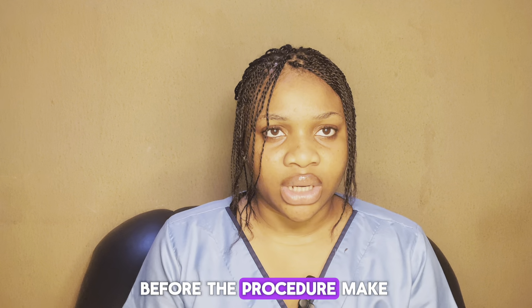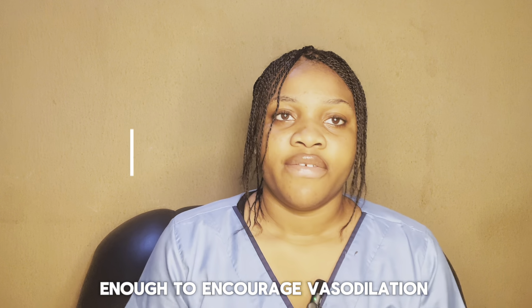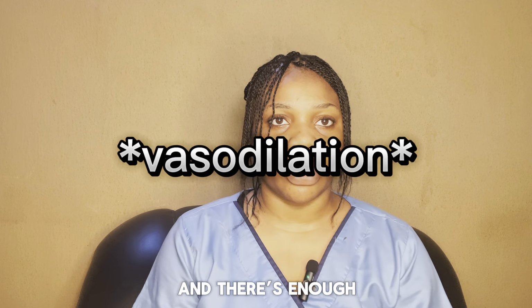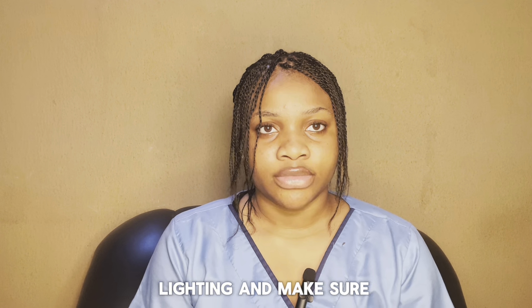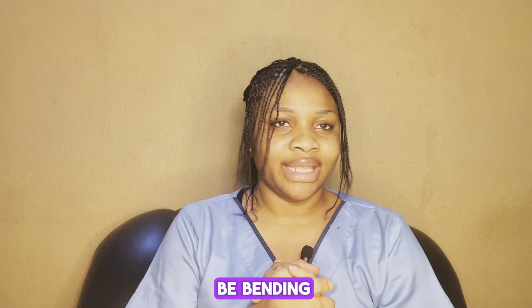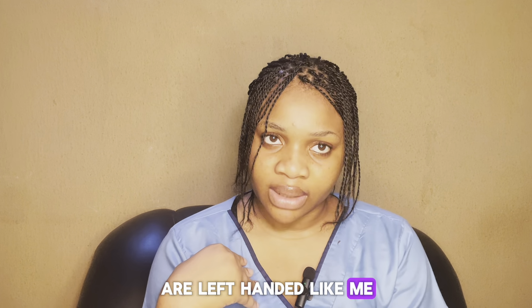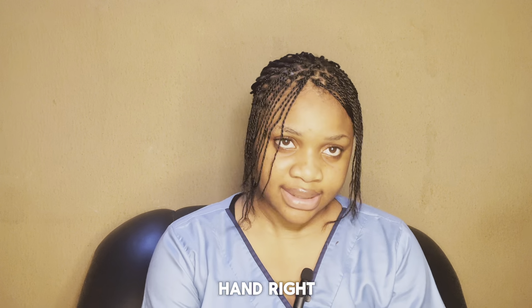Before the procedure, make sure that the room is warm enough to encourage vasodilation and there is enough lighting. And make sure that you are comfortable so that you will not be bending, then later start complaining of back pain. I don't know why some people don't like being comfortable. So you need to be comfortable and your patient is also comfortable before you start the procedure. And then the cannula should be placed in the non-dominant arm. That means that if you are left-handed like me, you're going to place the cannula in my right hand, right?